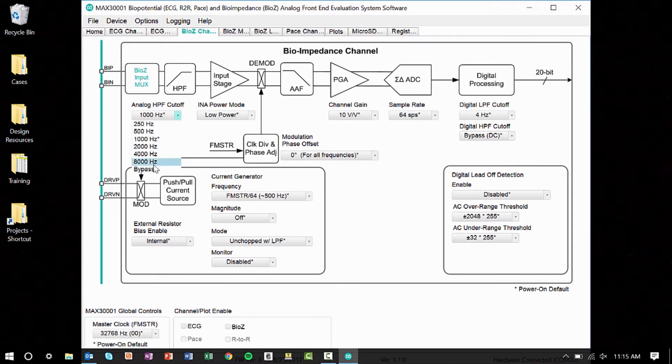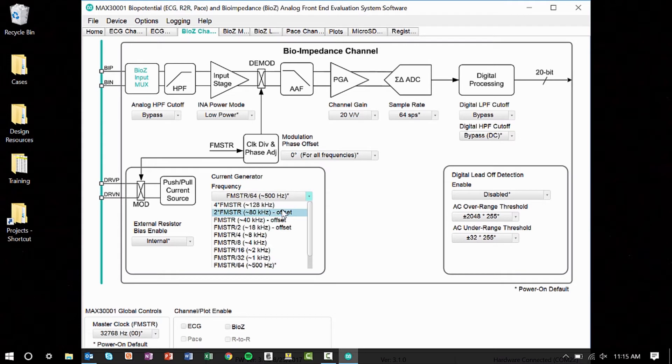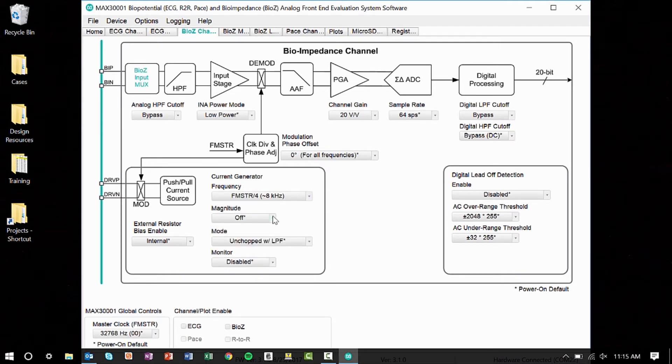Bypass the analog high-pass filter, set the channel gain to 20, and bypass the digital low-pass filter. Set the current generator frequency to 8 kilohertz, the magnitude to 8 microamps, the mode to chops with resistive common mode, and finally check the BioZ box at the bottom of the page.